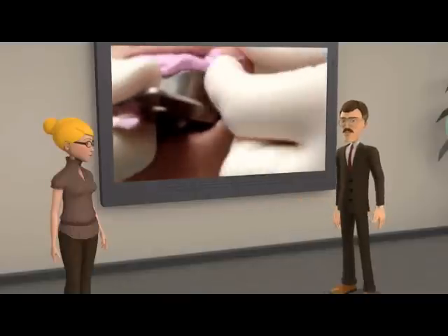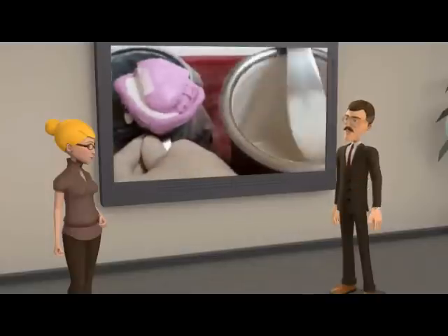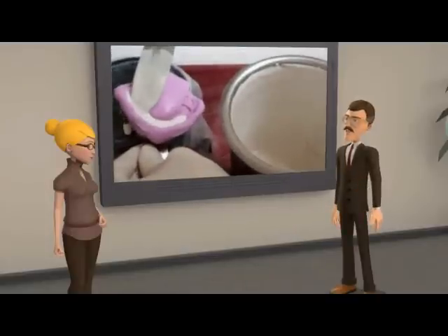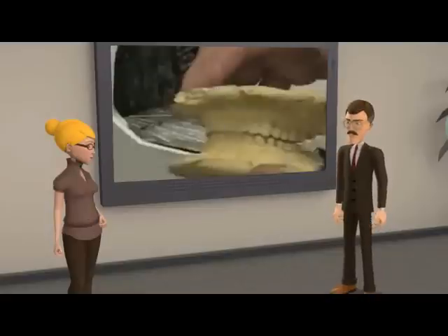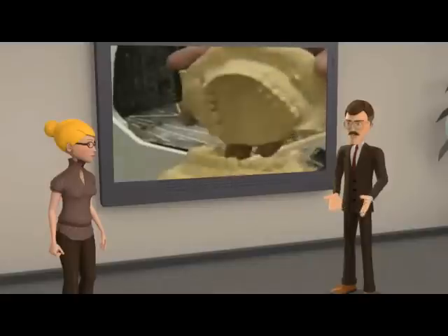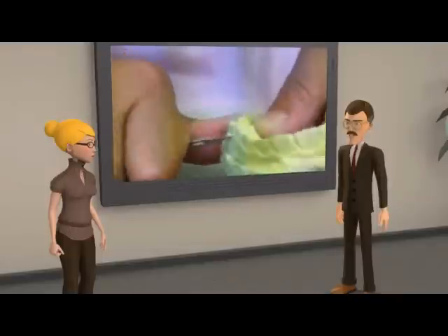Next, the impression is sent to a dental laboratory. Plaster is poured into the impression in order to make an exact duplicate of the mouth. The result is called a dental model. The model is then trimmed to get rid of excess plaster. Any voids in the model are filled, and any bubbles found are removed.